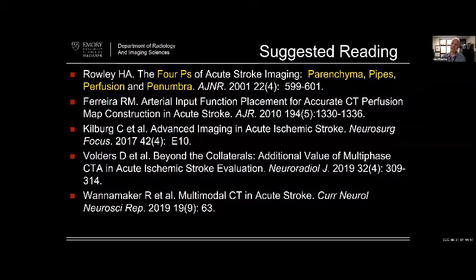I've practiced at another place where very commonly they'll do a non-contrast head CT and a CT perfusion and then go to catheter angiography. So they'll skip the CTA in that situation a lot of times. Not every time, but a lot of times. So different stroke centers, different stroke teams, different ways of handling things. But I chose to focus on the CTA for this one, which is generally what we do here most of the time. And do you use the Alberta scoring system routinely as a readout?